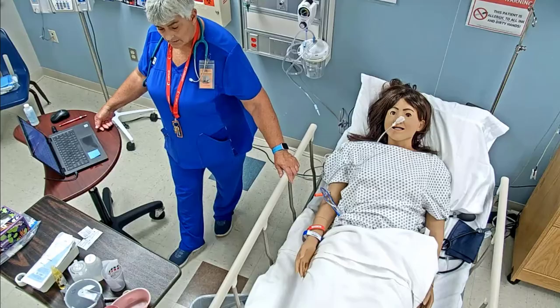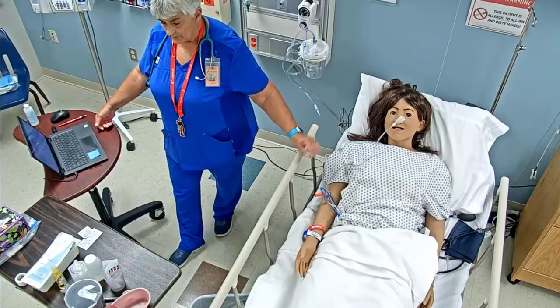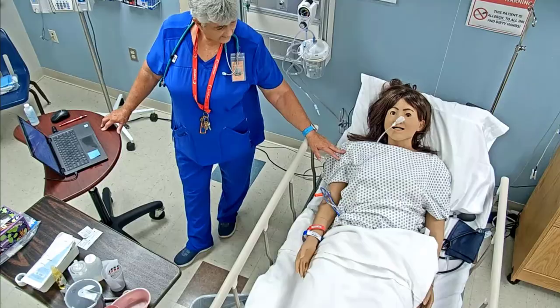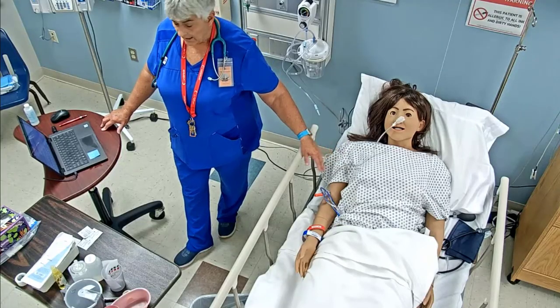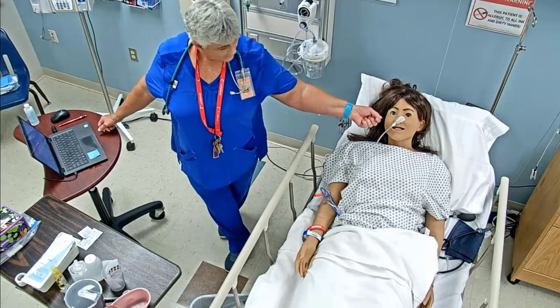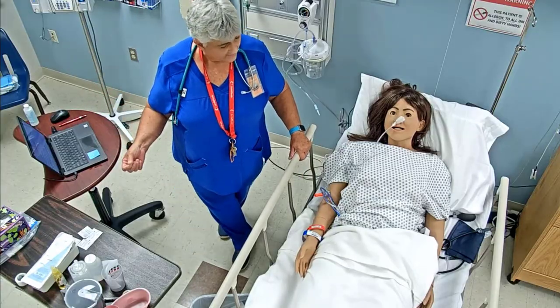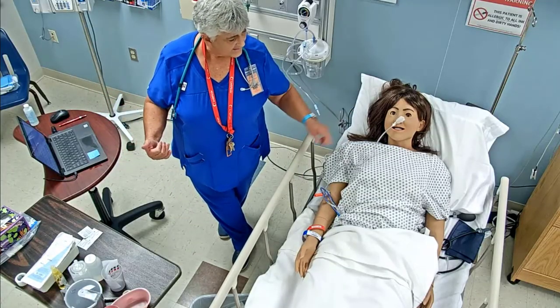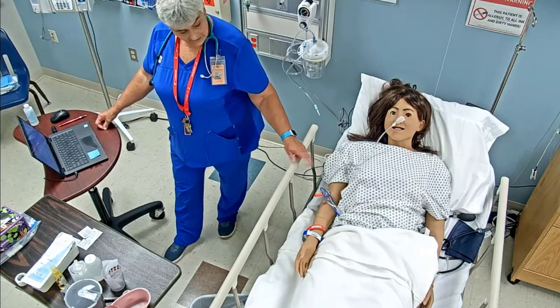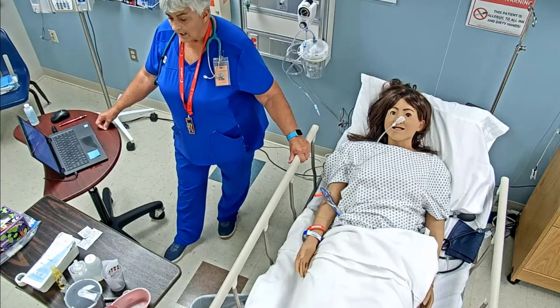So we're going to document what our assessment was prior to. We had a 16 French nasogastric tube, and we went through the right naris where our mark was on the tubing. Okay, so we need to make sure we document that so the nurses know, every time they come in, if the NG tube is still at the same length. And then we also assessed the gastric contents, okay?